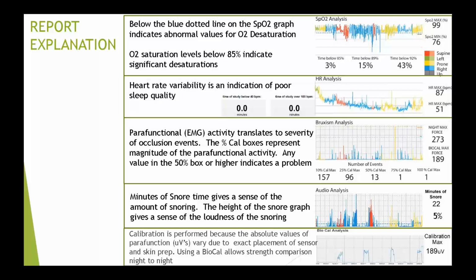When it's not, such as the case here, that indicates that the patient is very severe and has been for a long period of time, and the body's autonomic response to these oxygen desaturations has been dulled, or there's just no response at all. This is a sign that the patient's very sick.